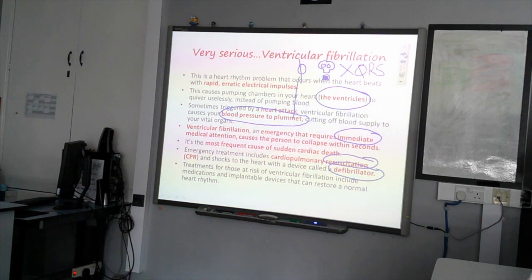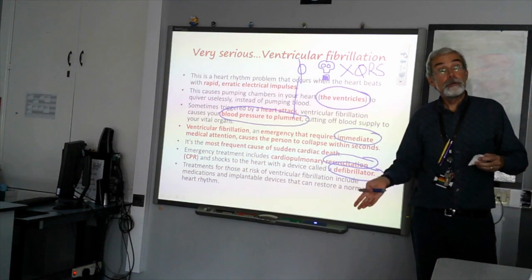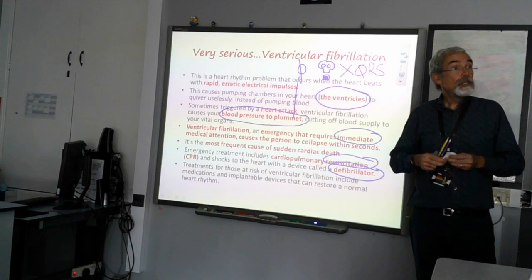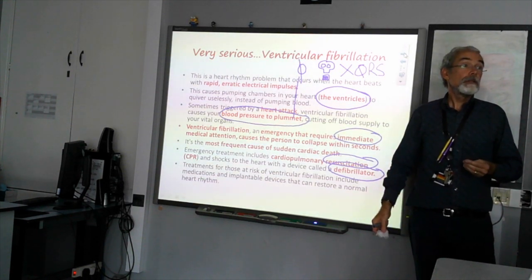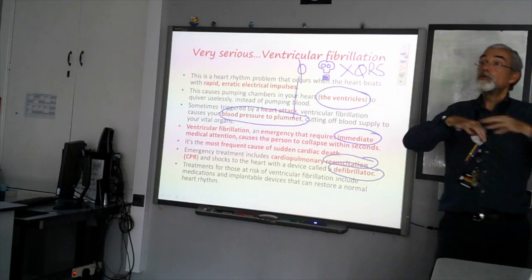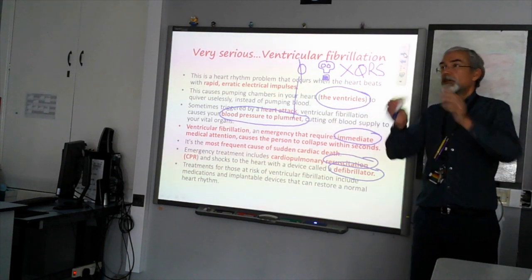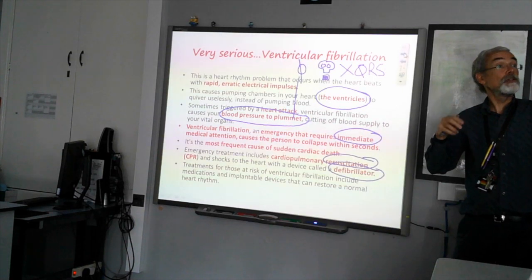Do we have a defibrillator in college? Yes, we do. I've not heard of anybody requiring to use one yet in college. Has anybody used a defibrillator? You have. So you know the instructions speak to you. It talks you through exactly what to do. And was yours American? I've never used one on a patient, but the ones I've used have an American accent. Now, open up the patient. It talks you through it, and it is relatively simple to do, but of course you're stressed to hell because somebody's dying in front of you.